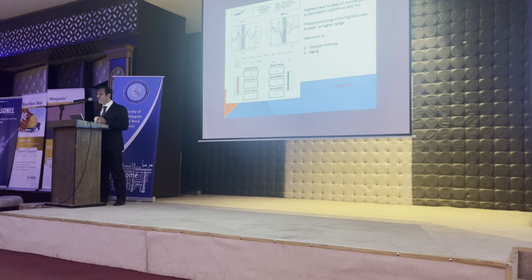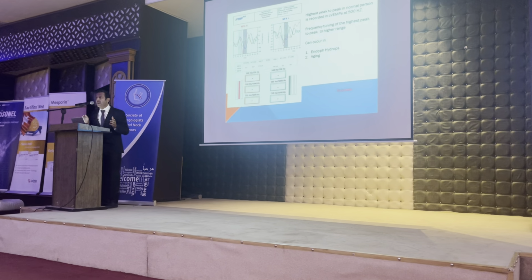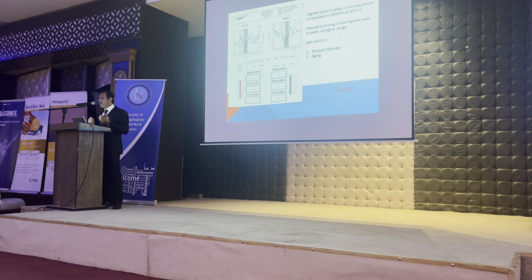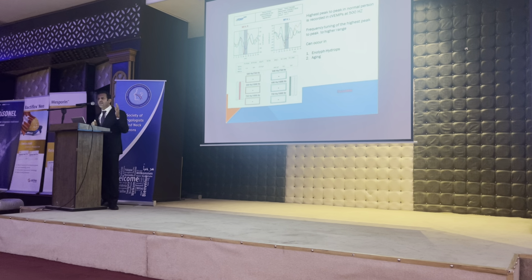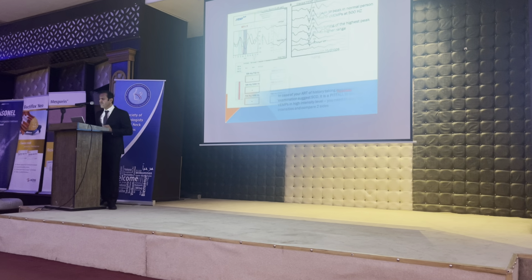And this is frequency tuning in a case of endolymphatic hydrops, but we should keep in mind that aging can also produce frequency tuning to higher frequencies. This is also useful in case of Meniere's disease because it is highly sensitive for endolymphatic hydrops. This test is very sensitive to endolymphatic hydrops.